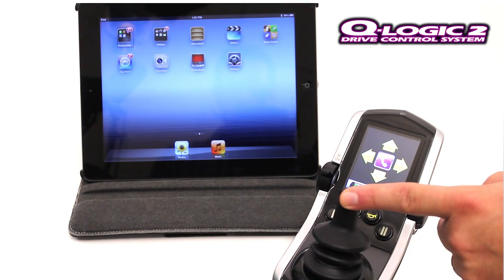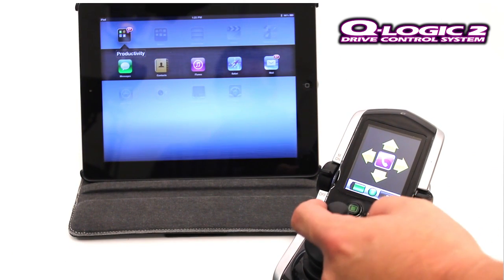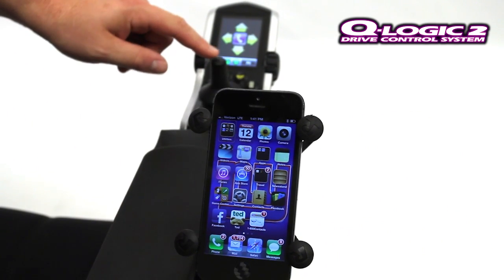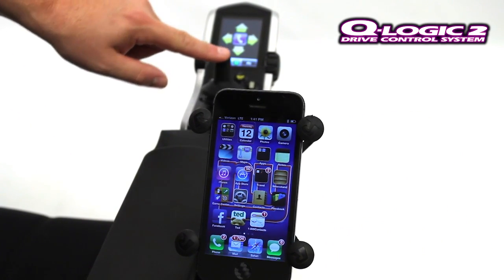For your clients that have Apple devices, you have the ability to connect with an iPhone or an iPad, utilizing the built-in VoiceOver application and the accessibility features of these devices. When connected to the iPhone or the iPad, your clients have the ability to navigate through the different applications on the screen, as well as select and return to their home screen when needed.